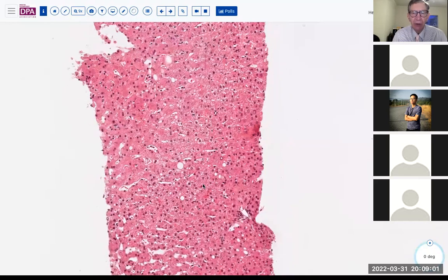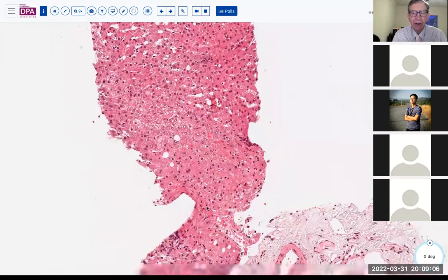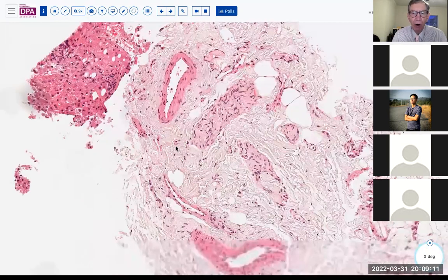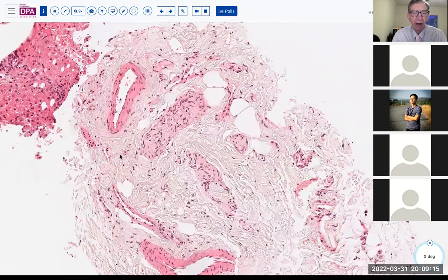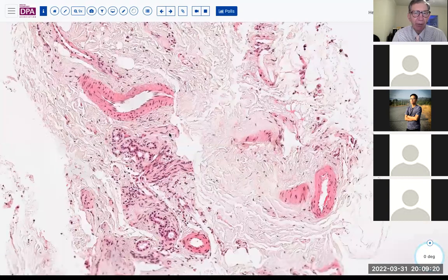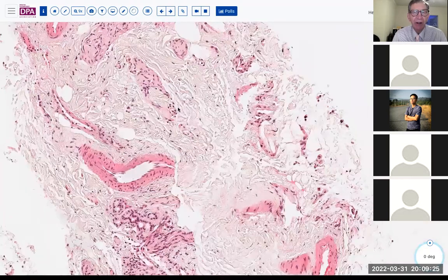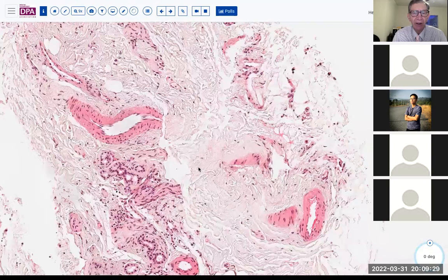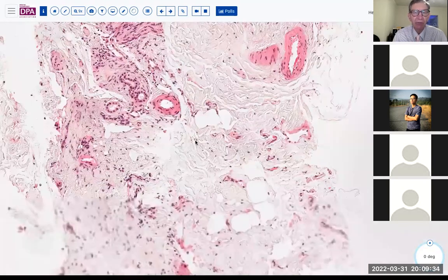So I think you can see as we go here, we have very little in the way of portal tissue. And then even when we get here, where we have a little bit more, we see a little arteriole, some veins, nerves. But this is the only biliary material we see. If we're in this size of a portal tract, we should see a pretty large bile duct, which we're really not seeing here. So this also would sort of reinforce that impression.